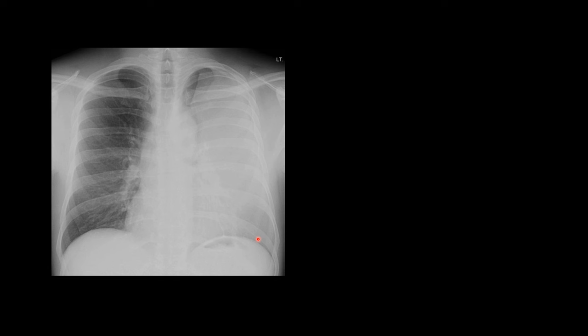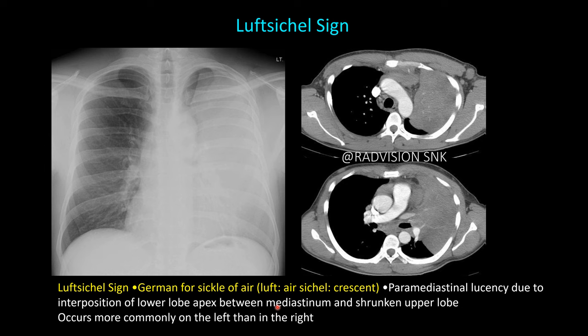Next case: there is homogeneous opacification of the left lung zone, but there is a crescent-shaped or sickle-shaped lucency noted in the para-mediastinal location. This is the collapsed upper lobe, and the lucency is the superior segment of the lower lobe trying to compensate for the loss of the upper lobe between the mediastinum and the collapsed upper lobe. This crescent is the Luftsichel sign — a German word where 'Luft' means air and 'Sichel' means crescent. On CT, you can clearly see the collapsed lobe and the lucent zone representing the apical segment of the lower lobe compensating for the upper lobe.